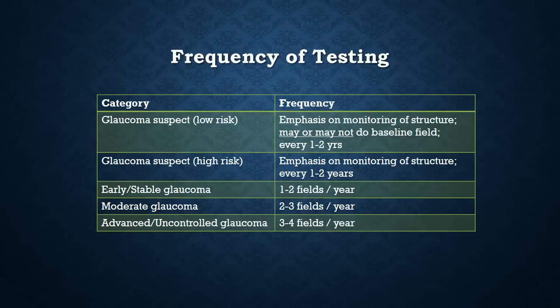These recommendations are after you've gotten your baseline tests. So this is for regular monitoring. So you need to get an initial baseline of 2 or 3 tests in the first year so that you have a reliable baseline for the long term.